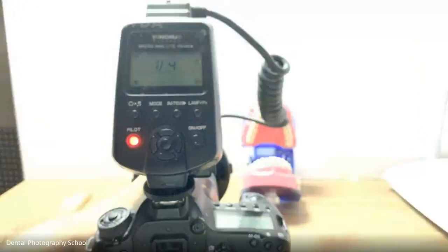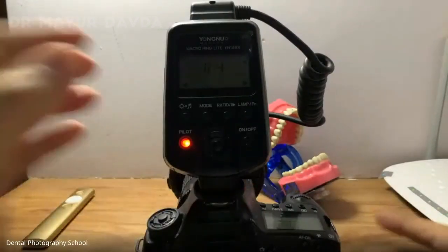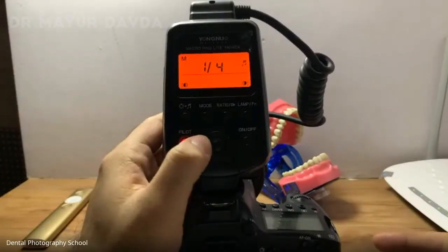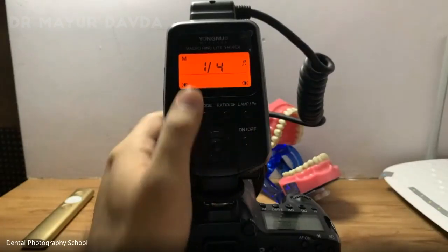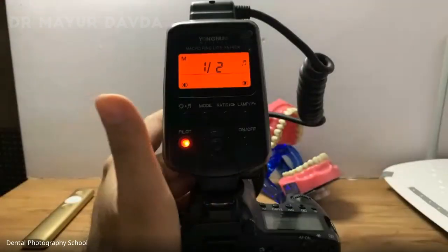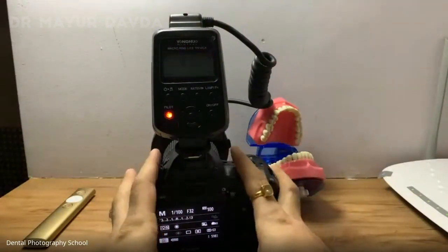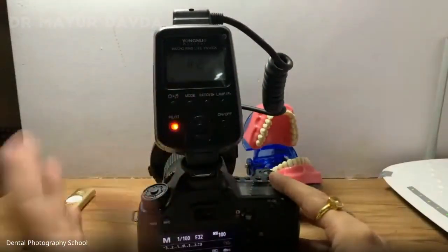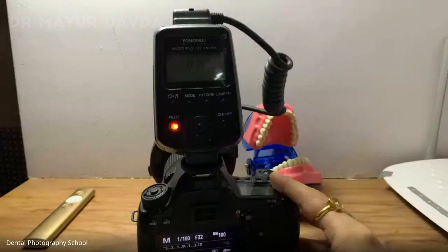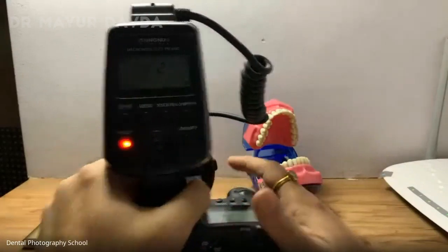The only thing that I play with is my flash power. So suppose the image that you got was a little too bright for you, what I would have done is reduce the flash power, say 1/8. If you think that the image was dark, I would have gone on the other side, that's 1/2. So basically what I'm telling you is in dental photography, you don't have to touch your camera at all. If you want to make the image look brighter, increase the flash power, and if you want to make it darker, reduce the flash power. That's all you have to do in dental photography and documentation.